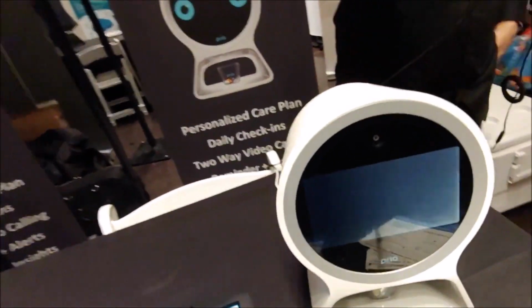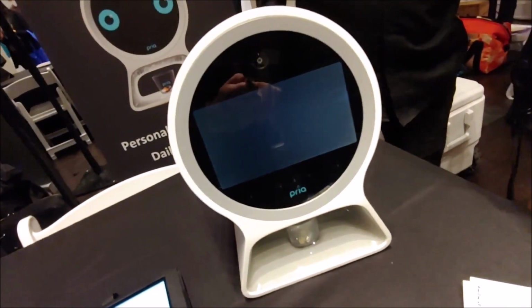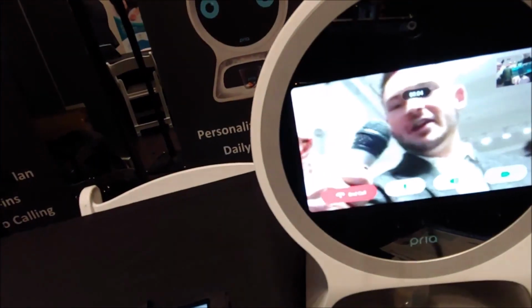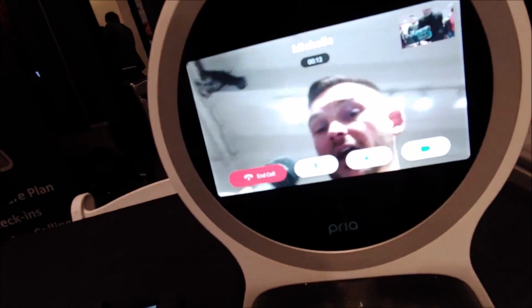Okay. Can you almost use it as Skype? I mean, like, can mom walk in front of it and I can actually show you. So let's say I'm at work and want to give mom a call. I can actually do that. We get to be on the camera here while mom is in the kitchen. So we could just be at work and video call mom, and vice versa. Mom could call you. She could say, okay, call Mike, and the device will actually video call me while I'm at work.